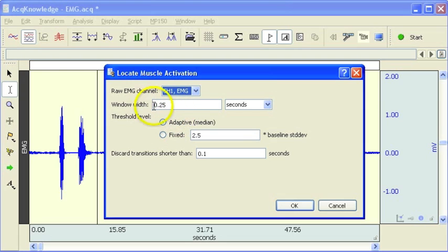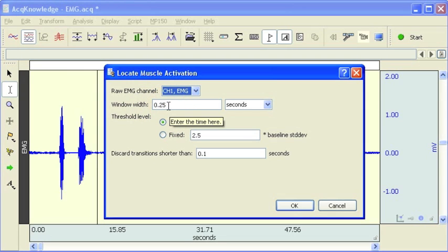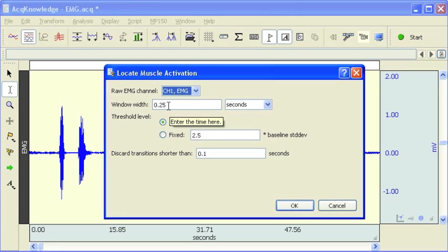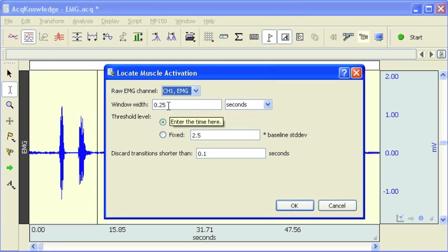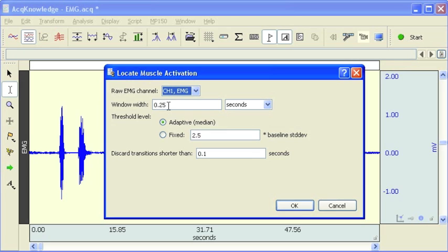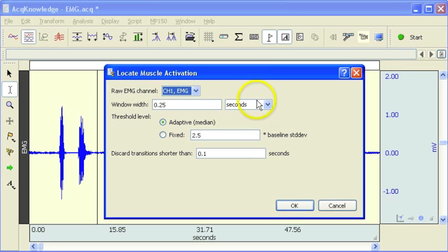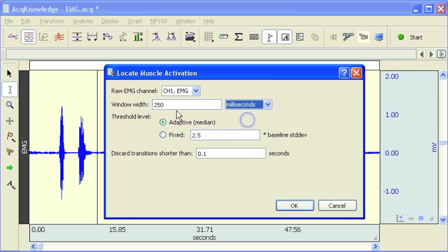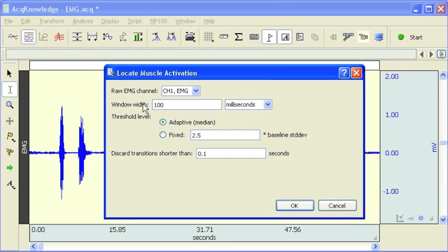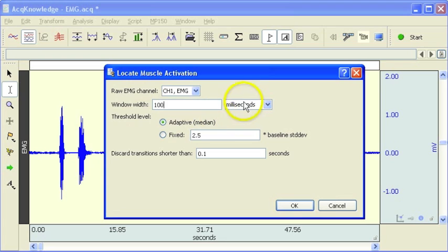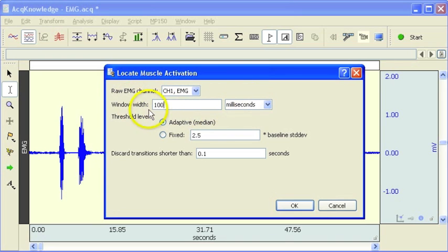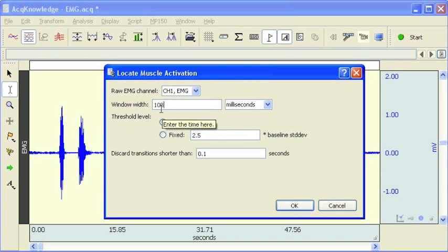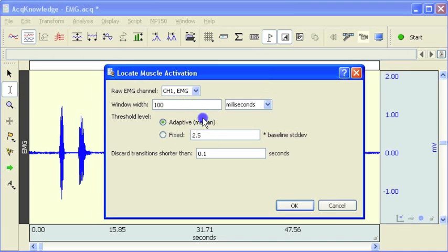We're then asked for a window width. What the software is going to do to start off with is create an integrated EMG waveform, and it needs to know the time window to perform the integration over. So I'm going to set this at 100 milliseconds, which should be good enough. We won't actually see the result of the integrated EMG, but it's going to do that in the background.